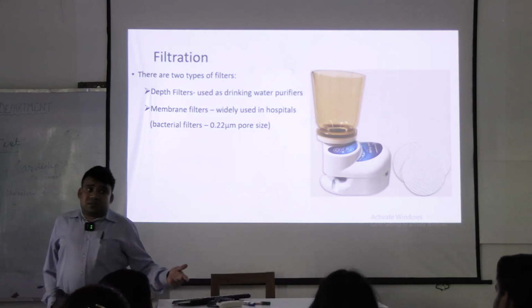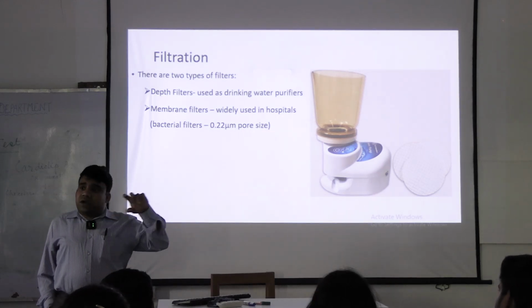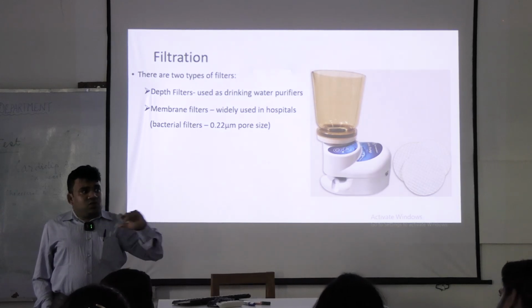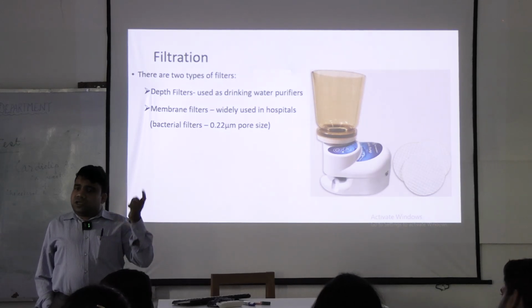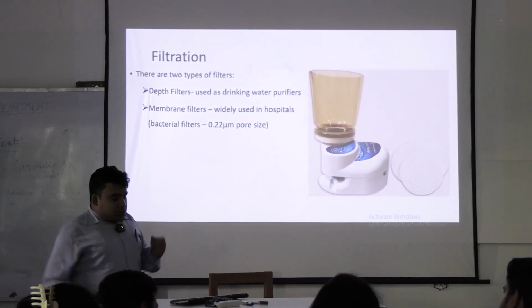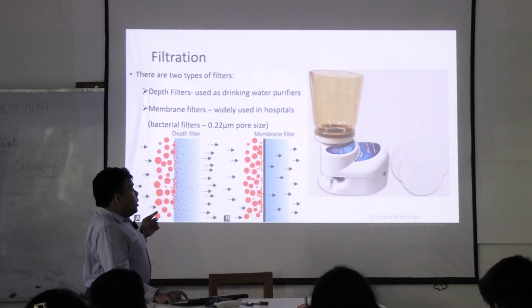Like in a dialysis machine, you will find that there is a dialysate fluid which goes into the patient's body and comes back again. So we need to filter that also. So those are commonly done by membrane filter.